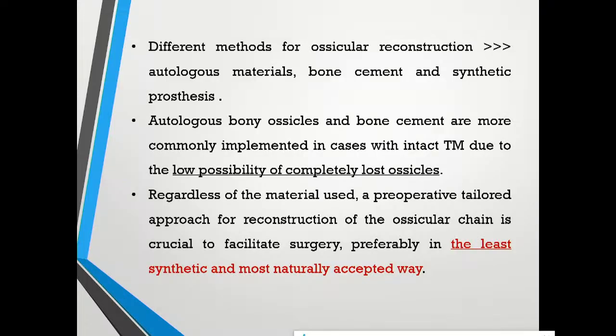As we heard in the previous lecture, there are various materials used in reconstruction. The one used in this series is a bone cement. This approach depends on reconnection of the ossicles in the least synthetic, most natural, and also cost-effectively accepted way.